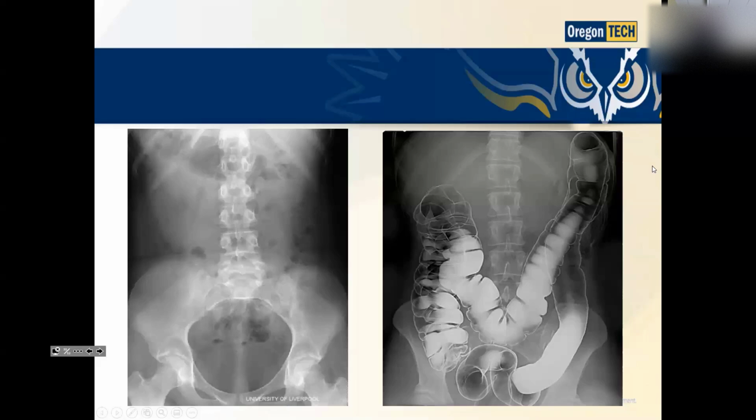Prone is correct. You have to think about the anatomy. Here's the cecum, the ileocecal valve. Actually, you can see the appendix right there.